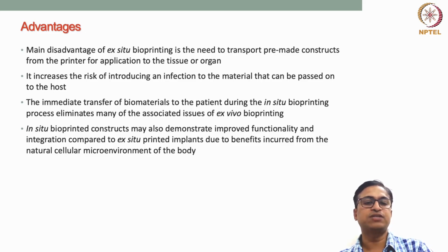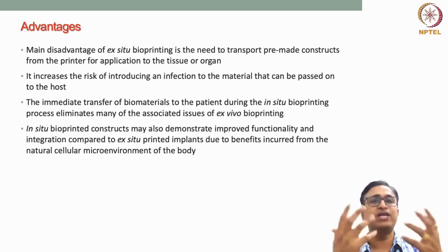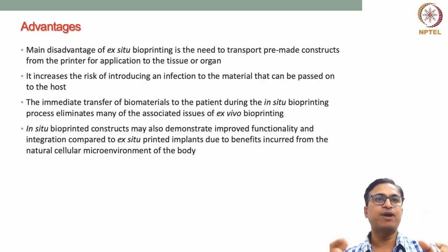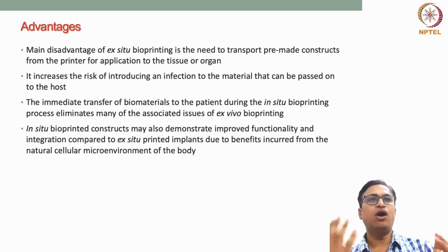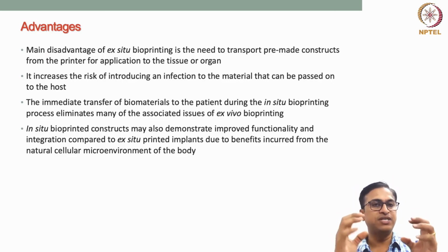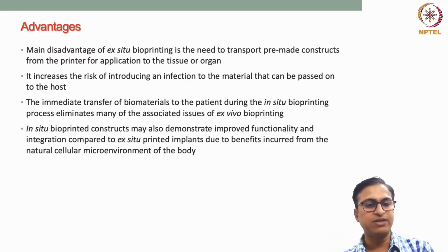In situ bioprinted constructs may also demonstrate improved functionality and integration compared to ex situ printed implants due to benefits incurred from the natural cellular microenvironment of the body. This is another thing. When you directly print a structure on the body, that body cellular microenvironment is providing a bioreactor kind of function. So that is providing all the necessary conditions to the bioprinted constructs, right? All types of signaling mechanisms can be possible, where we print the structure directly on the wound bed.